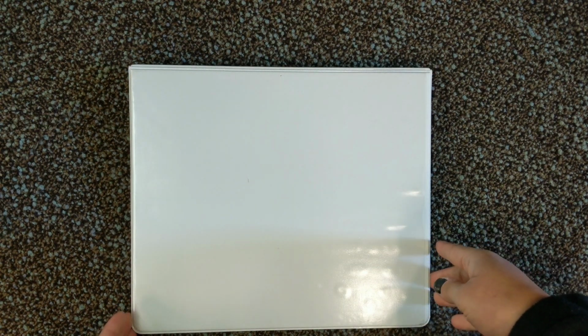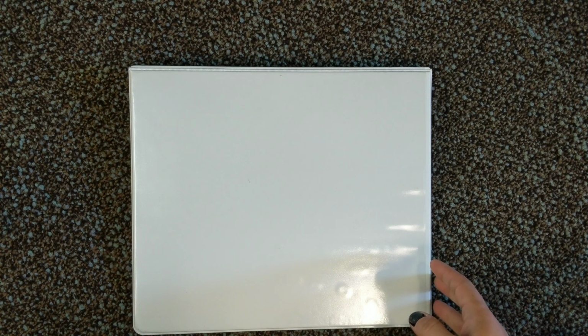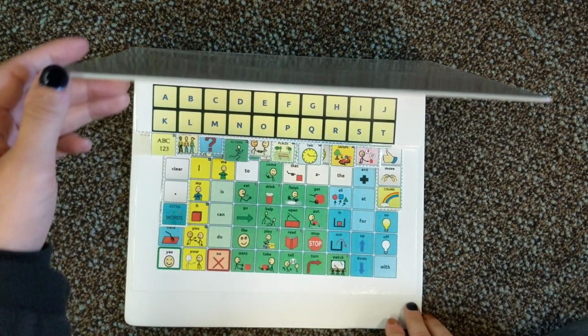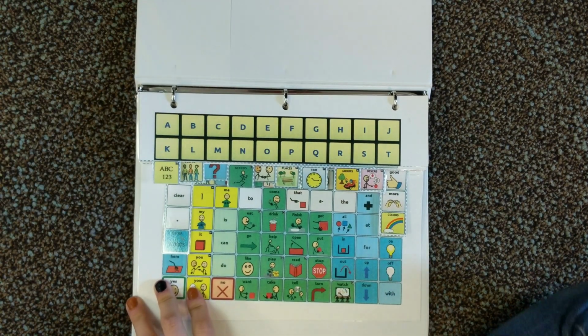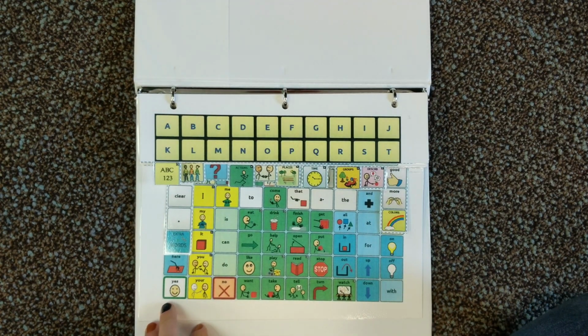I'm going to show you a little bit about the chat binder. So this is just a low-tech version of what some of the students use on their AAC device. Typically this program is on an iPad. It's called Touch Chat, and this is just kind of a version of it on paper in a binder. So this is a low-tech, something we use sometimes when we're trialing communication systems for kiddos.